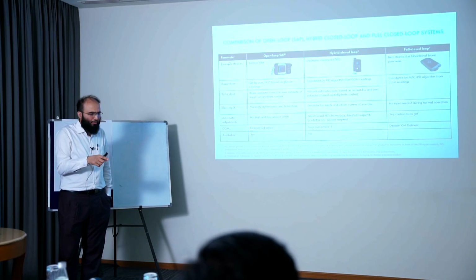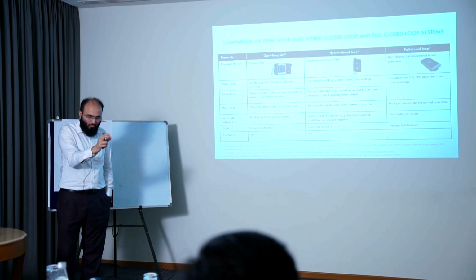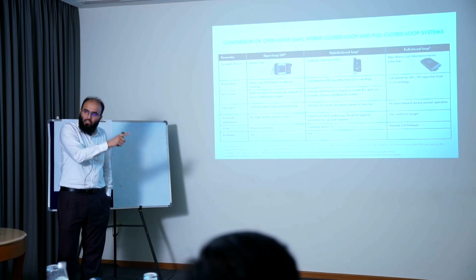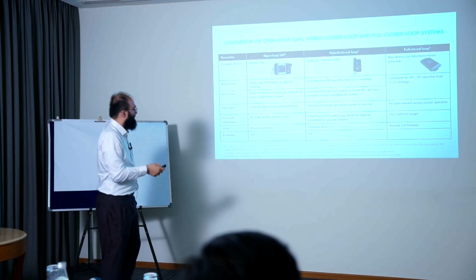How much is his total daily dose? This much. Basal dose, how much are we giving? Say around 20 units is being given, 24 units is being given. So based on that, you give 1 unit per hour, the rate is set up for this patient. Manually it is set up by us.